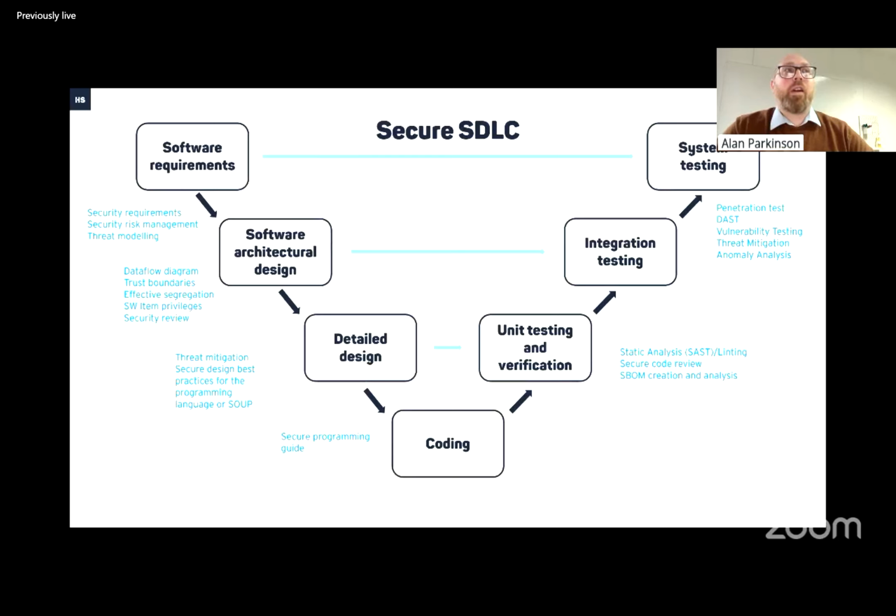We've got dynamic analysis and vulnerability testing. So they're very much part of the same category. So you can use tools to do fuzzing on all your interfaces with your device, look at ways that data is being checked before it's being processed, so it doesn't cause a security issue. You also need to show your tests that trace back to your threat mitigation.